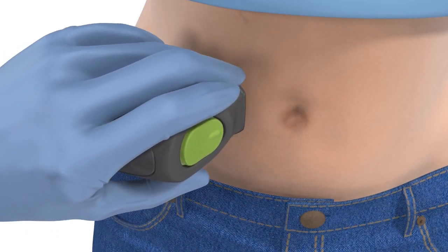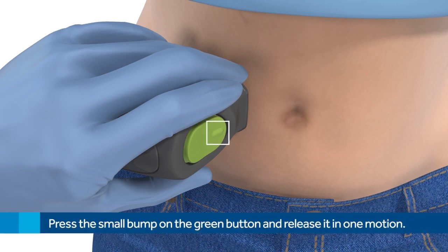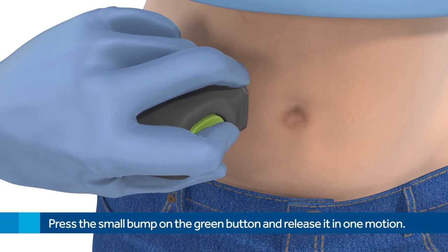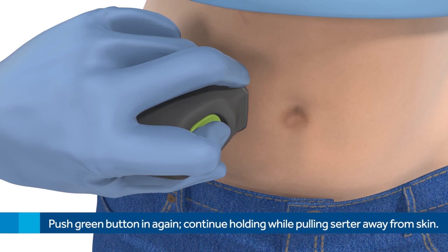Place the Sertor flat against the skin and do not push the Sertor into the skin. Press and release the bump on the green button — when you release the green button is when the sensor inserts. Hold the Sertor against the skin to allow the adhesive time to stick. Then press and continue to hold the green button while you slowly pull the Sertor away.